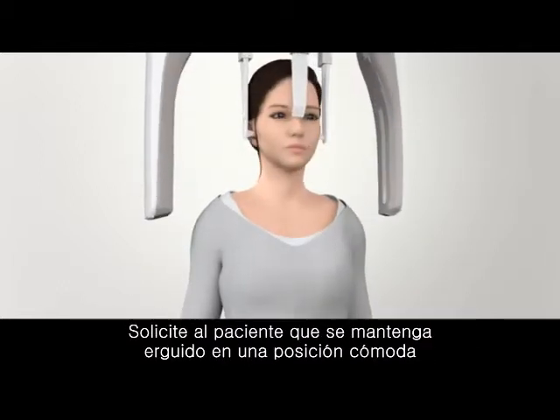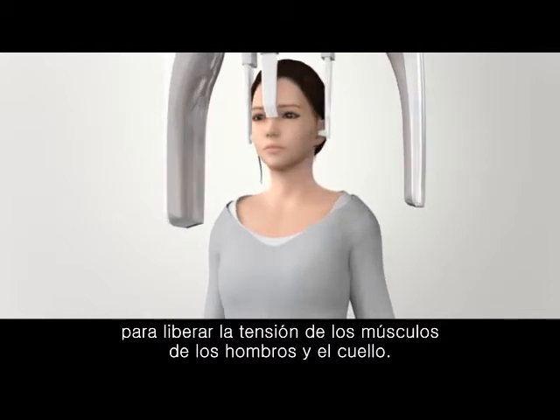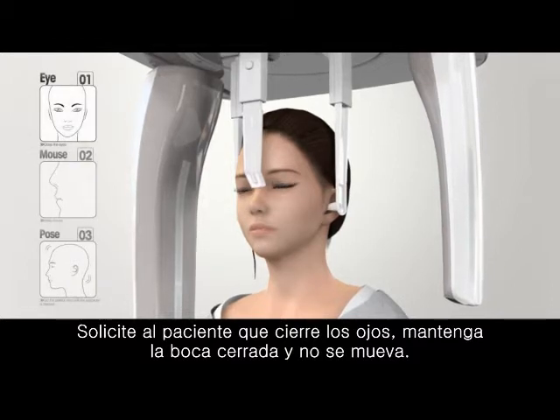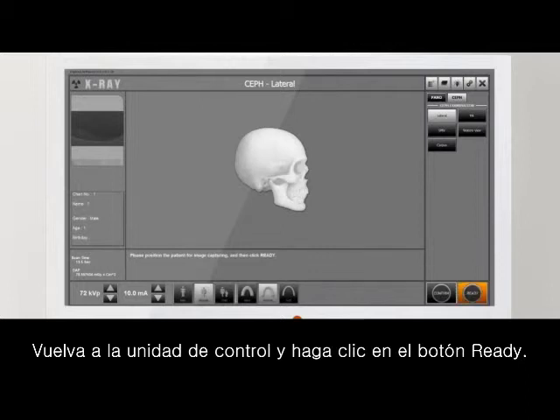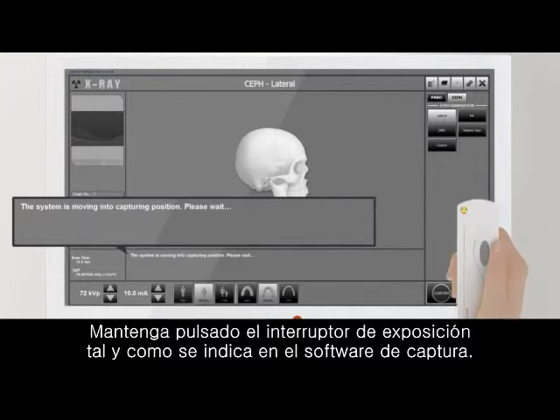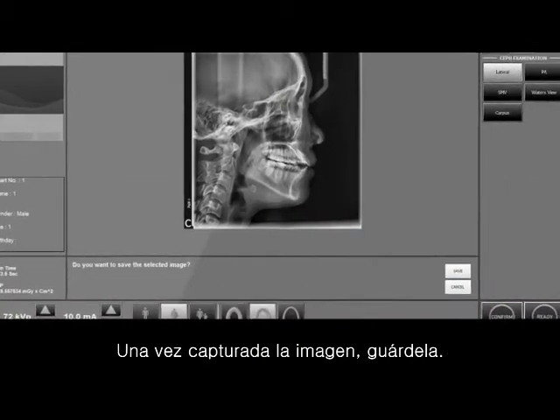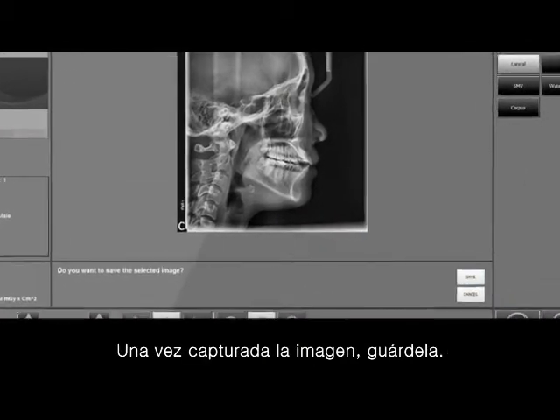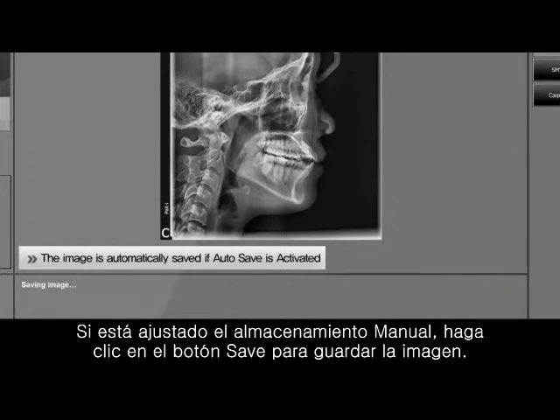Ask the patient to stand straight up in a comfortable position to release tension in the shoulder and neck muscles. Ask the patient to close their eyes, keep their mouth closed, and not to move. Back at the control unit, click the ready button. Press and hold the exposure switch as guided in the capture software. While the exposure switch is held, radiation is exposed and the system proceeds to take the images. After image acquisition, save the captured image. If manual save is set, click the save button to save the image.